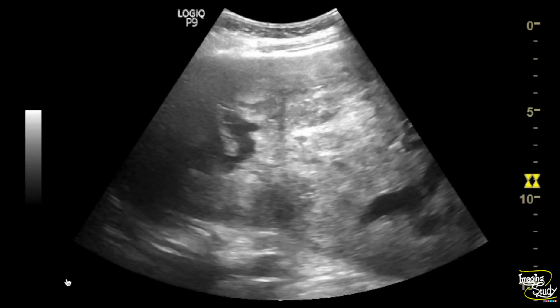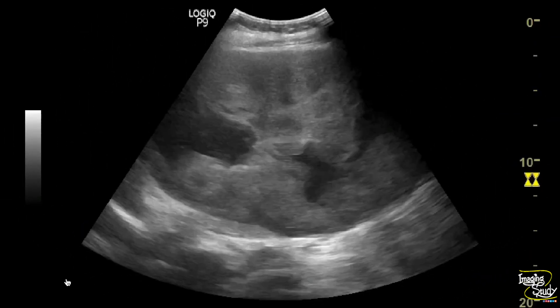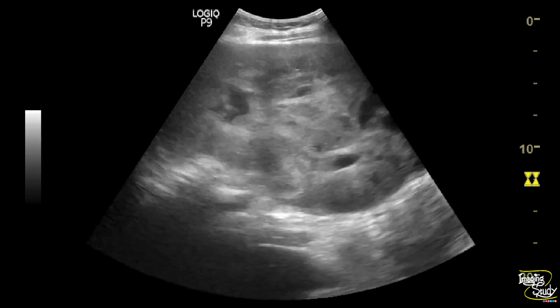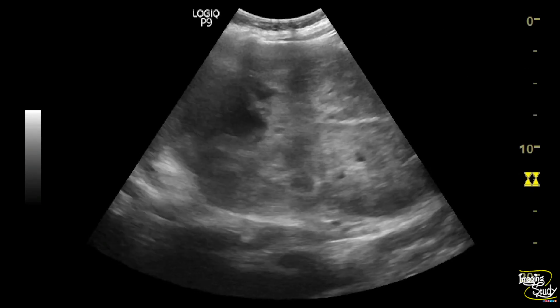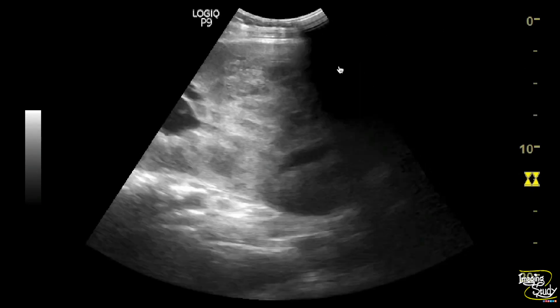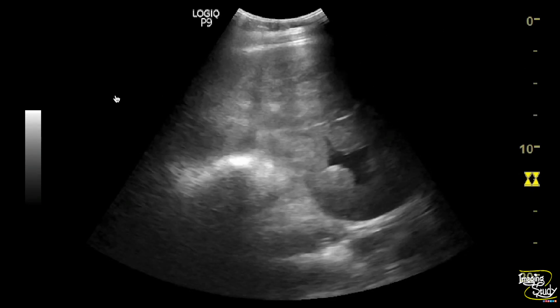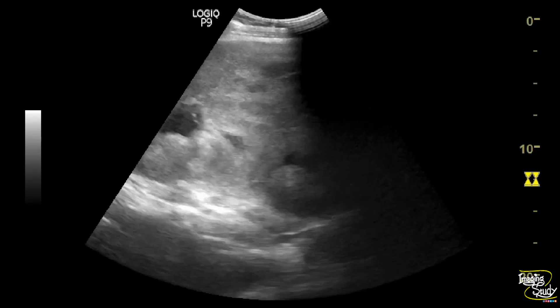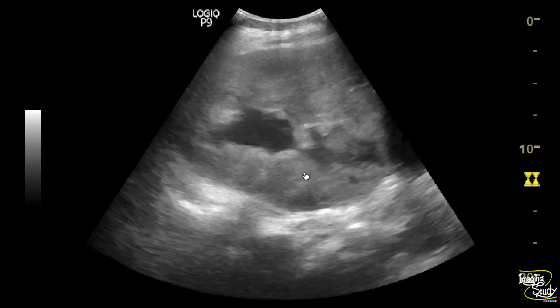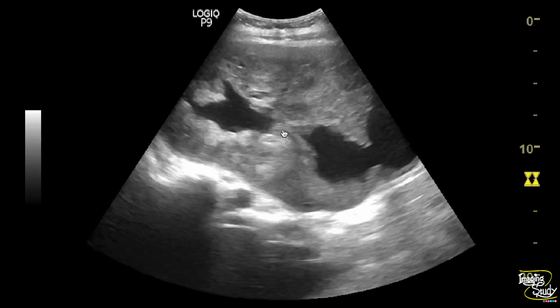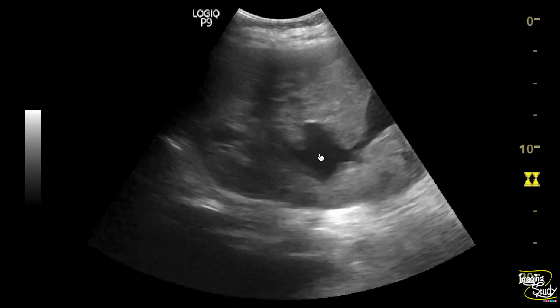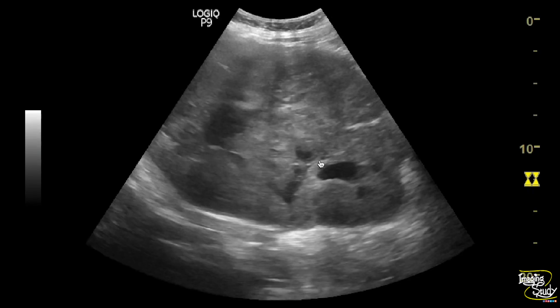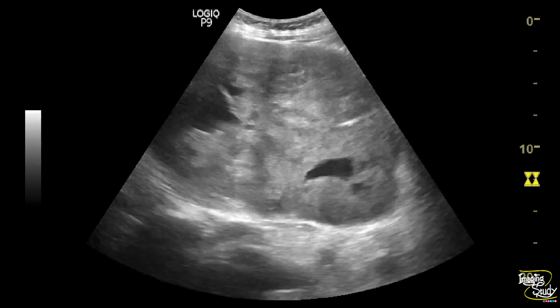Now let's look at the left kidney. The left kidney is grossly enlarged in size. The parenchyma is heterogeneously echogenic with complete loss of normal echotexture. You can see collection within the pelvicalyceal system, and the collection is quite hazy due to inflammatory debris.